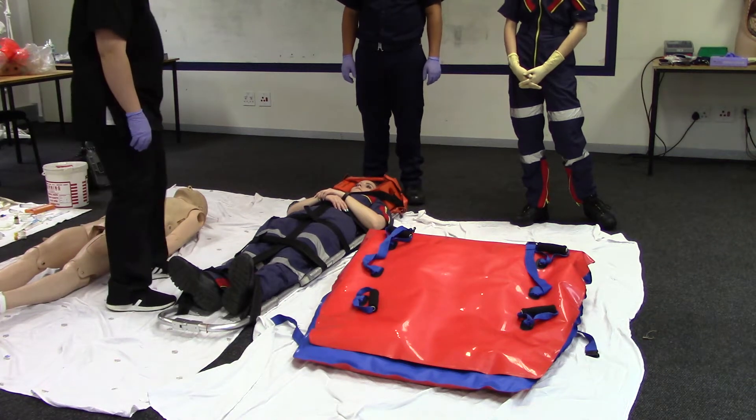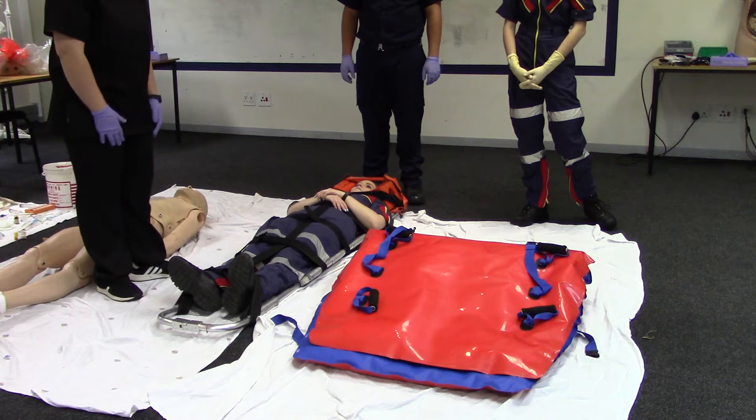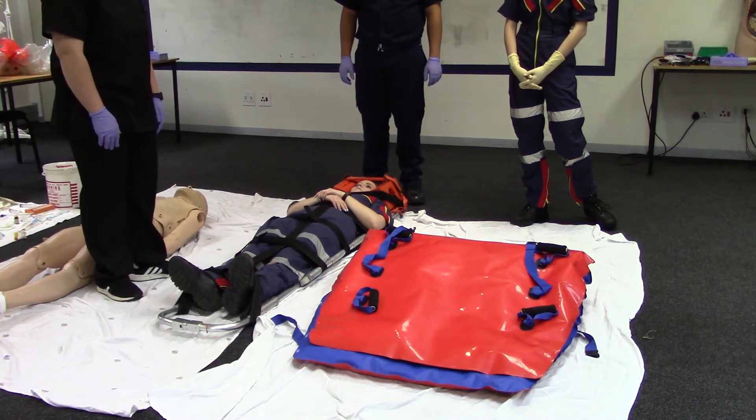Immobilization of a patient on a vacuum mattress. First, assess the need for immobilization on a vacuum mattress.